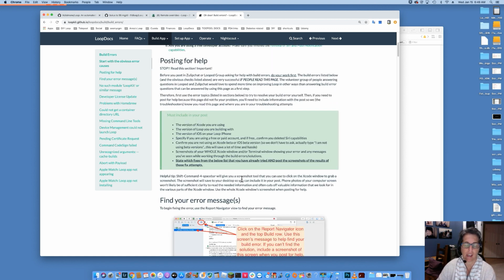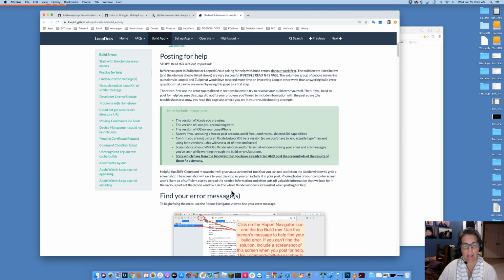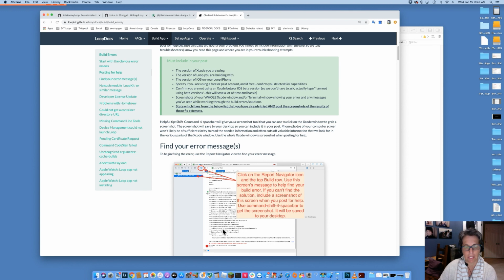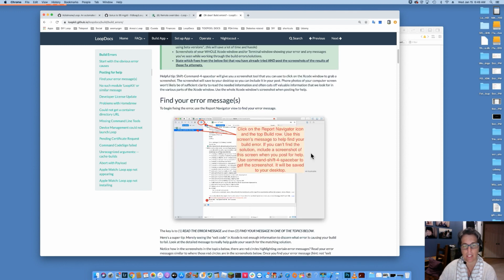If you get stuck and you absolutely can't find your error message or the solution isn't working, then when you post, include all the things in this green box. Confirm what versions you're using, what Loop you're building with, your iOS that you're using, all of those things. Don't assume them, go and check. Check your Xcode version, check your iOS on the phone, and post that, and then include screenshots of the report navigator so that we can see all the error messages. Take the whole window screenshot. We want to see the entire window. It gives us a lot of information.